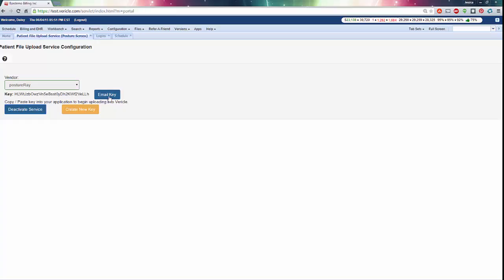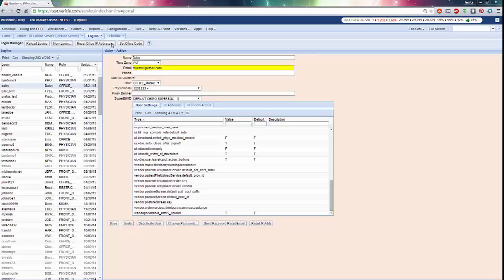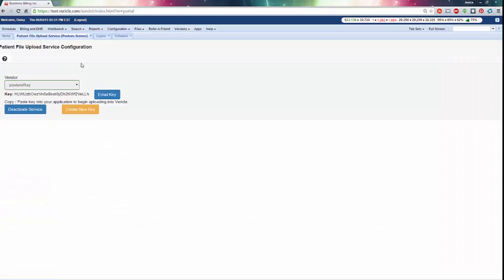You can now email this key to the address associated with your login. If that email address is not accessible on the iPad or the computer that has the program, you can type the displayed key into Posture Screen or Posture Ray. Emailing it just allows you to copy and paste.